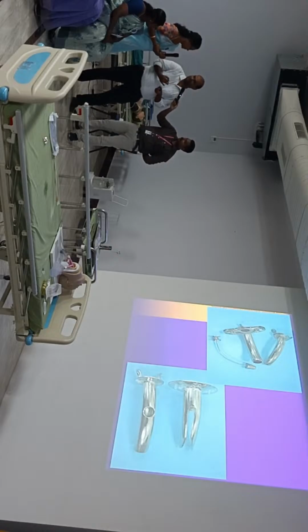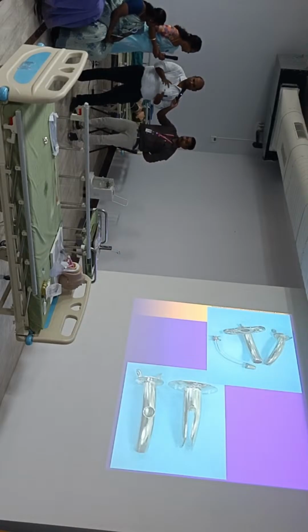The other advantage is this has a hole here, isn't it? So if the patient wants to speak, close the block here, air will enter through here, and the patient will be able to vocalize. But that cannot be done with that Jackson's tube. Both these tubes cannot be ventilated.